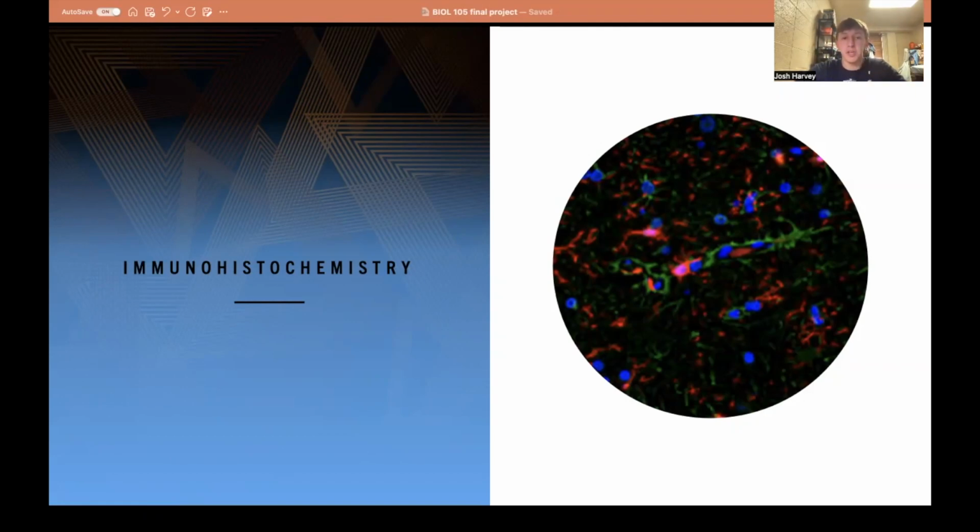In their most recent publication, Karen Labs utilized immunohistochemistry as an assay to visualize the presence of the GPRC5B G protein coupled receptor, among other receptors. This test helped to shine light on the importance of GPRC5B and its prevalence in the development of the lymphatic system. Immunohistochemistry is also important in a much wider sense throughout the medical field.